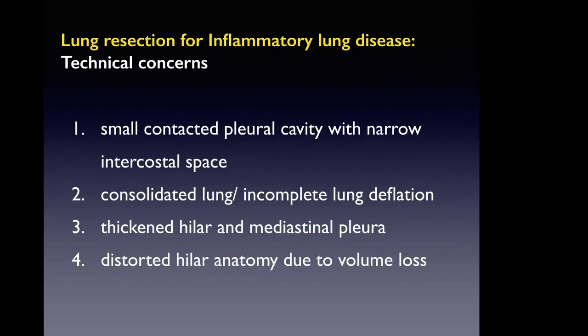Okay. So lung resection for inflammatory disease, the technical concerns are as follows. One is you have a small contracted pleural cavity with a narrow intercostal space, so just entering the chest is really a great difficulty. If you have a dense adhesion along the access port that we use for uniportal, that's already a difficult thing. So you have to correlate with the X-ray and CT scan whether you have adhesions in that area.